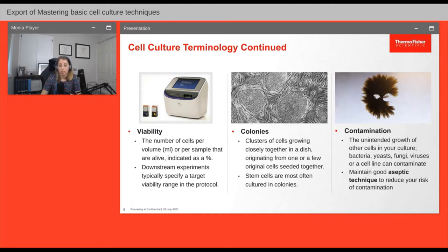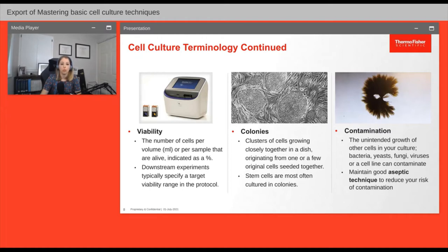If you're growing stem cells, you may be familiar with round clusters of cells called colonies, which originate from a single or small number of cells — you often want to maintain small fragments of those colonies when passaging stem cells. On the topic of contamination, if you notice your cell culture medium is cloudy or you see fuzzy growth in your flask, you likely have bacterial or fungal contamination respectively. It is extremely important to follow the rules of aseptic technique to reduce the risk of contamination.